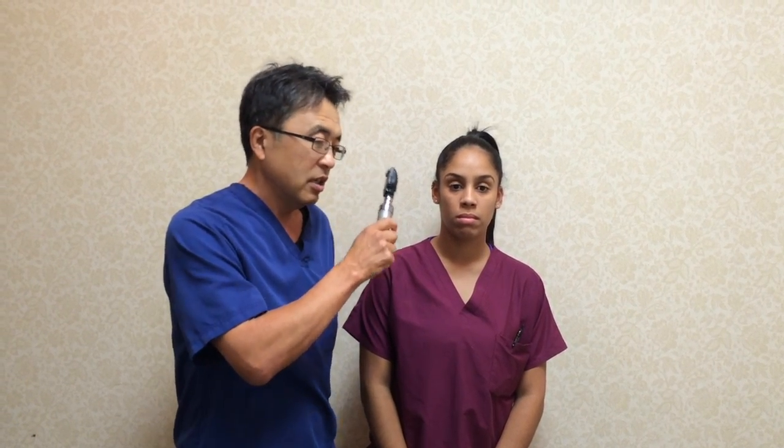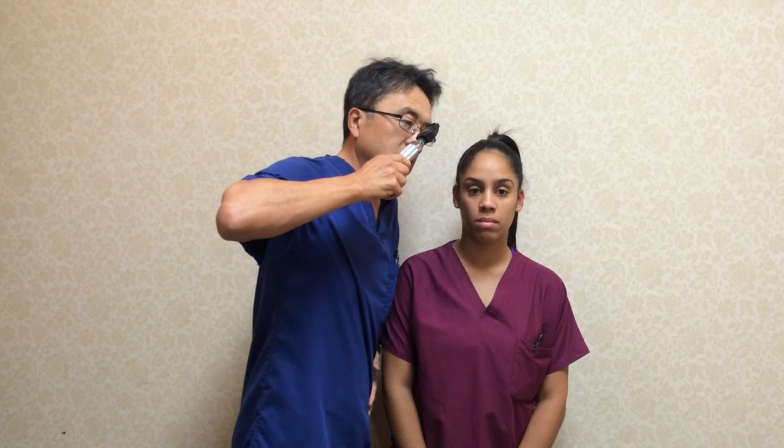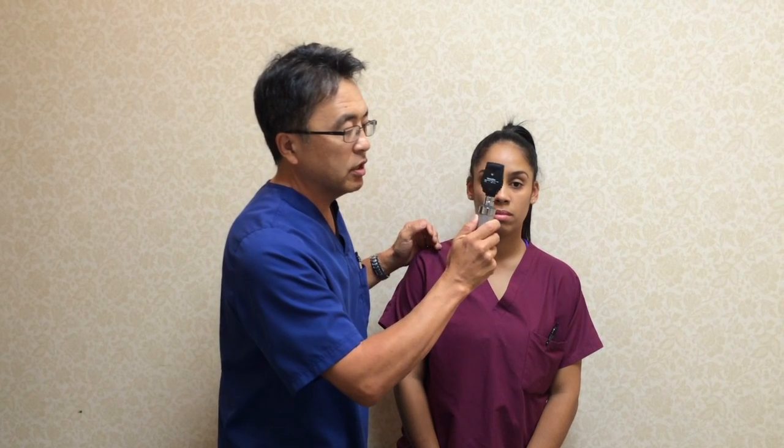In my opinion, unless they have cataracts or some trouble with their cornea, average time for you to find the disc should be less than five seconds. If you can't find the disc in less than five seconds, you might find this a very useful tip. Now when I've taught this to medical students, I find that they make some little errors. If they are looking straight across, you have to be at that same level. So if you're too much taller, looking down, you won't find it either. The first thing you have to do is sit down so that you're level. Knowing that it's 15 degrees off the axis of the gaze, I start at approximately 30 to 45 degrees, then look inside.